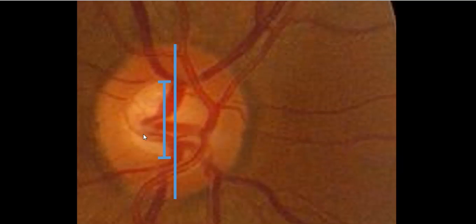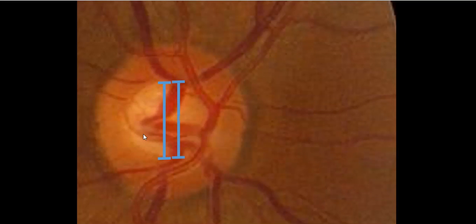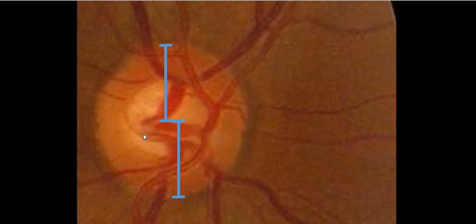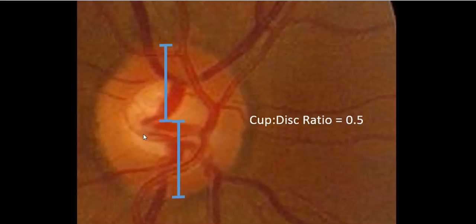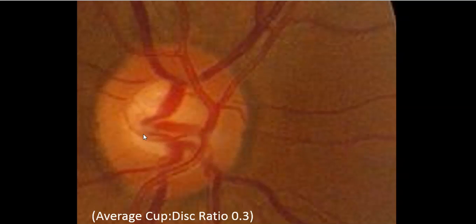The vertical length of the cup is half the length of the entire optic nerve. If I duplicate my line here and move it accordingly, we see that the line we drew for the size of the cup works out to half the size of the optic nerve itself. So in this case, I chose a cup-disc ratio of 0.5. In a normal population the average would be smaller — probably about one-third — where the cup accounts for about a third of the diameter of the whole optic disc.